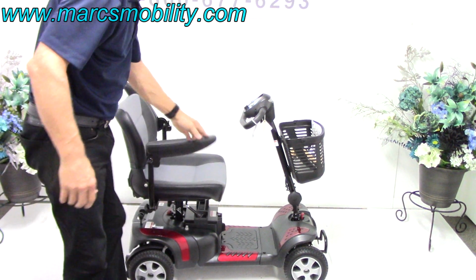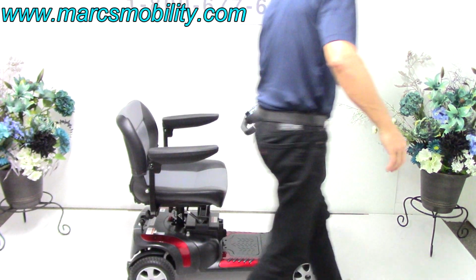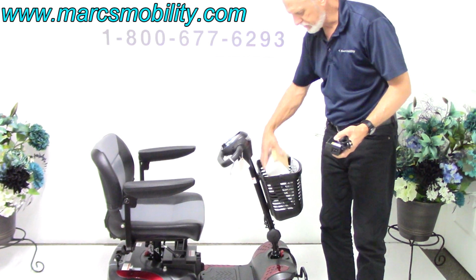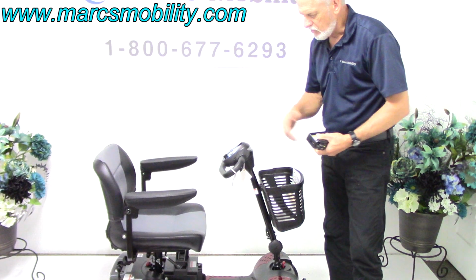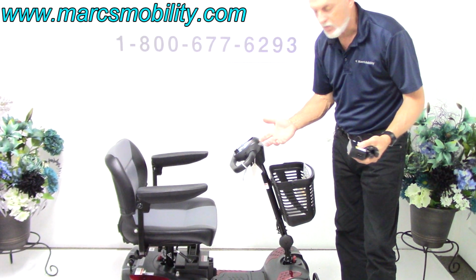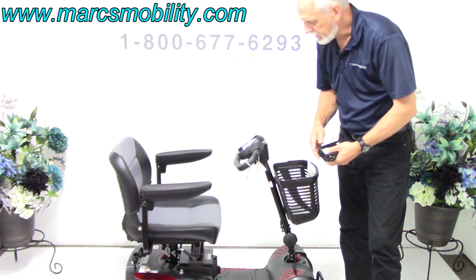When you charge the scooter, you have a real small charger that comes with it, and I would suggest you carry the charger with you, because if you use the scooter all day and you're nervous your batteries are getting low, when you eat supper, plug it in for an hour while you're eating.